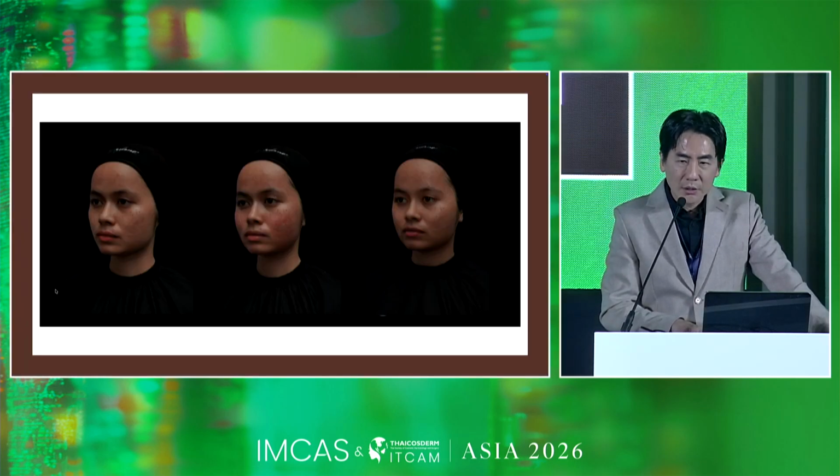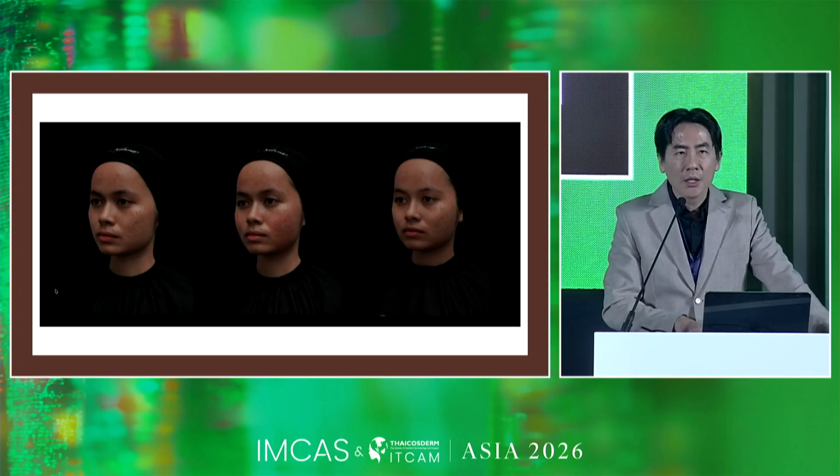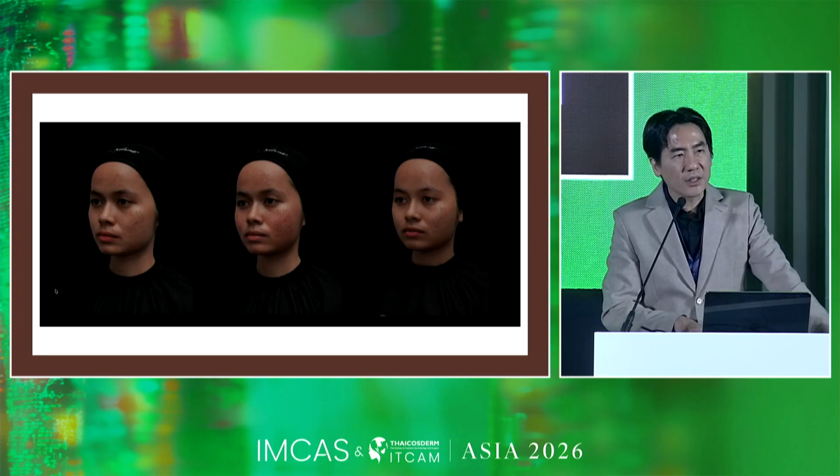This one, before, immediately after. What do patients expect after the treatment? Just slight erythema. The slight erythema normally goes away in 1 day only, because we create just small ablations in our skin surface. That's why normally you have the inflammation for just 1 day, slight inflammation, and then it's completely gone on the second day.